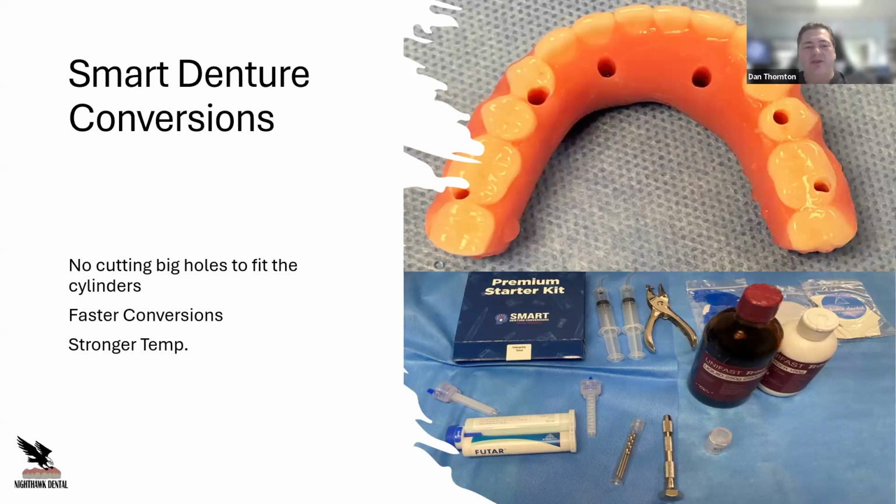Now, the only issue is the cylinder is not OEM. So if you have a doctor that wants OEM parts, the cylinders are not OEM, but it's only a temp. It's only going to be in there for hopefully 4 to 6 months. And then when you get to the finals, that's when everything can go back to OEM if that's what the doc wants and everything else. Myself, I stick OEM unless I'm actually asked not to. Then I would change how I order stuff.